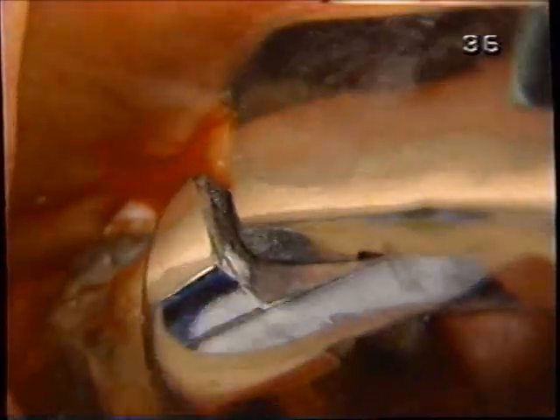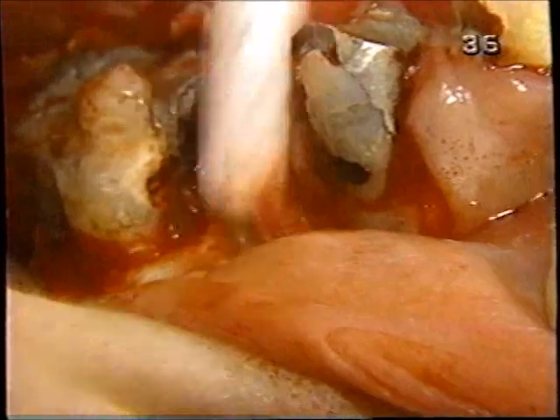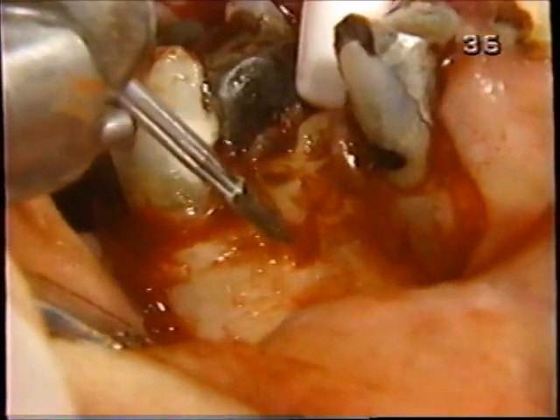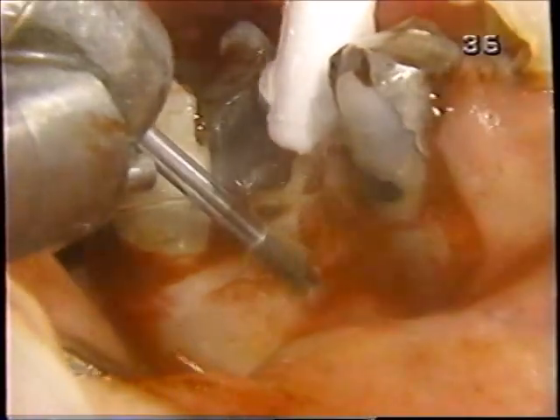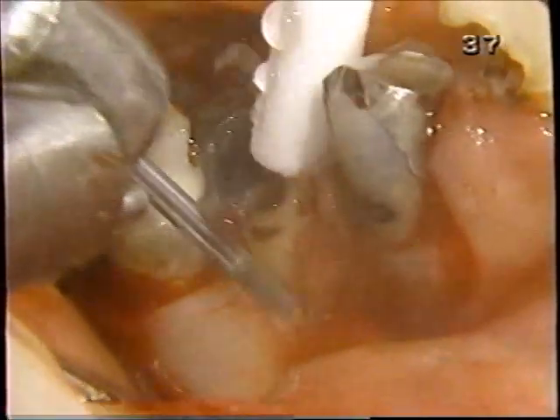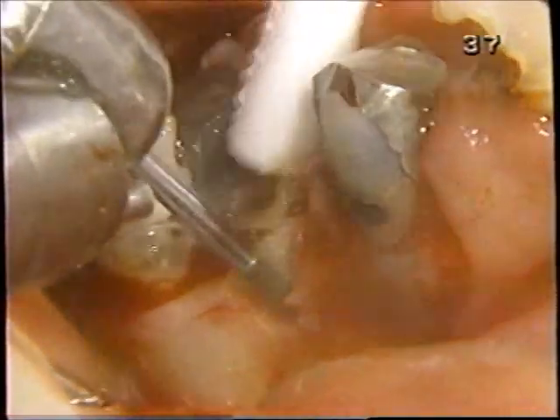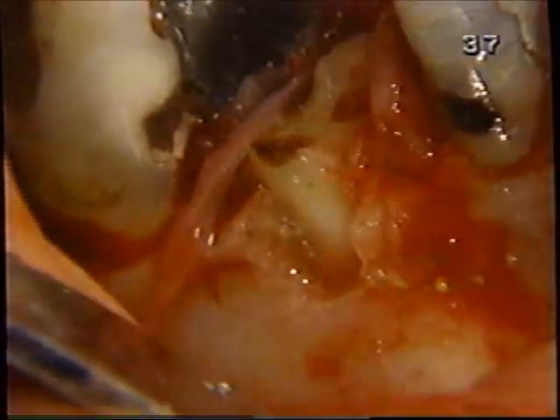Keep it clean if you would. We're going to try this, and it'll work or not, and we won't try it too long because we have other options. Let's go to those other options. And we're not going all the way to the apex with this. We'll go down maybe a couple millimeters and try again. This is bone that, by the way, will fill in. Maybe a slight concavity on healing, but not extensive. Just the width of the tooth and then down along the tooth. We've gone maybe 5 millimeters, 4 millimeters from where we were.